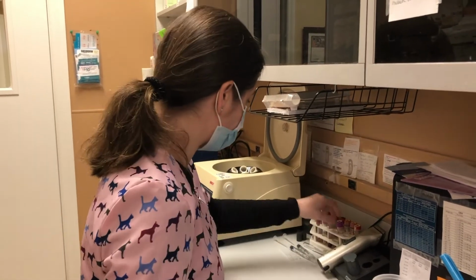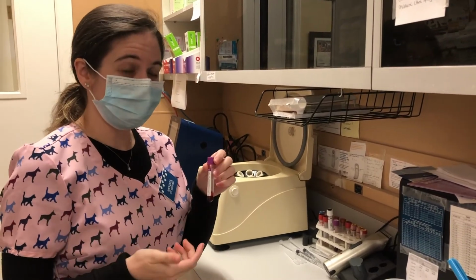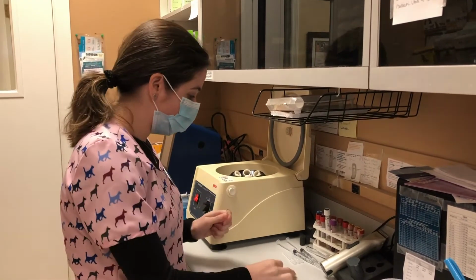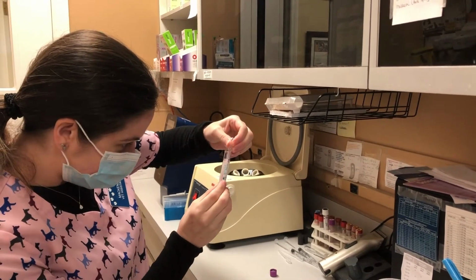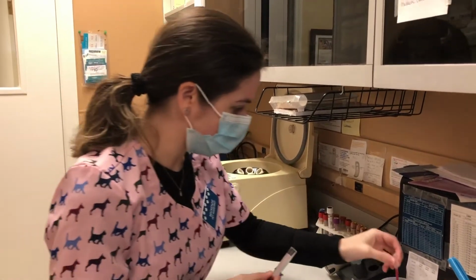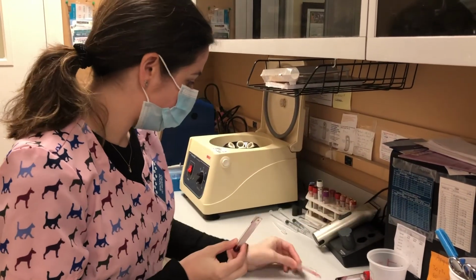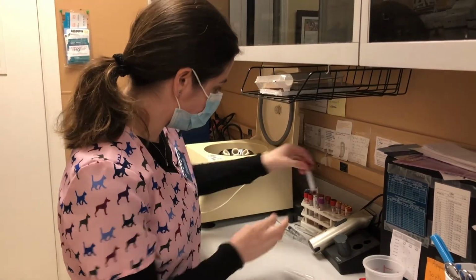My next step is to take my plasma, and we're not going to be using it. We want our packed red blood cells at the bottom, so I'm taking my plasma and getting that out of the way. That's for my donor.